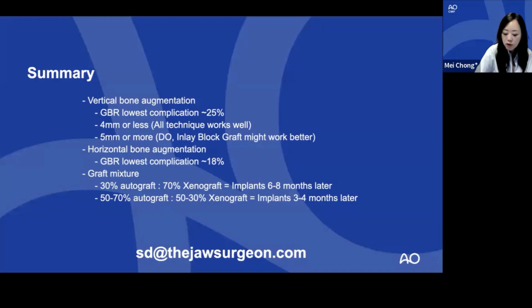What about grafting the incisive canal? You know, in the anterior region, sometimes we encounter bone where the incisive canal may be very prominent. You haven't shown any cases where you find them. Do you usually graft them or just leave them behind? Or what kind of graft material would you use if you have to?